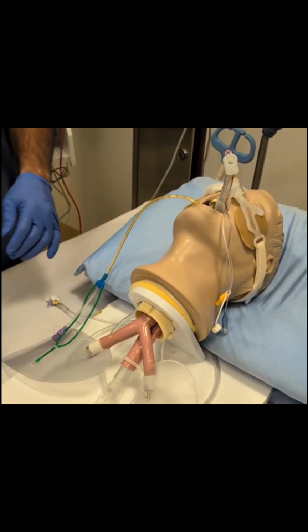After getting the transpulmonary PEEP and plateau, remove the air from the balloon and cap the esophageal balloon port.